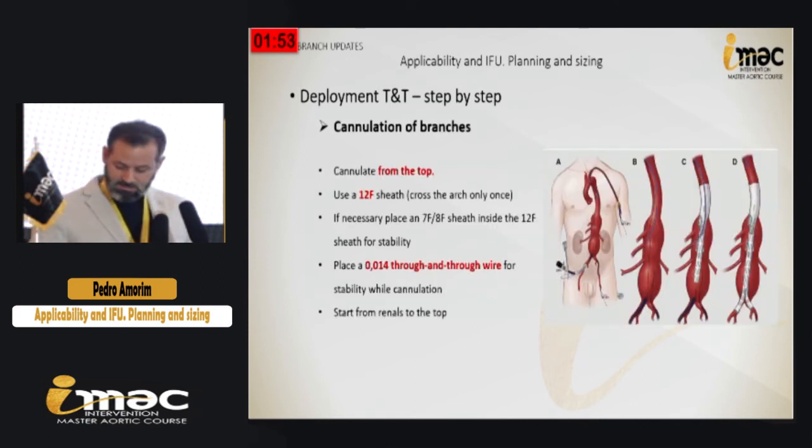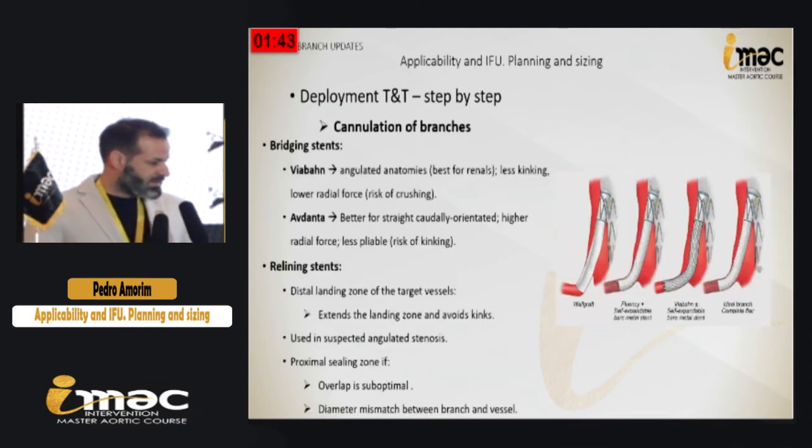The cannulation, we come always from top. Some people do it from below with special sheaths, but we come from above. And another thing that I wanted to mention is that we need to have plenty of solutions, a good armamentarium in terms of bridging stents. We need to play with lengths, with diameters, with radial forces. We need to have plenty of solutions available.